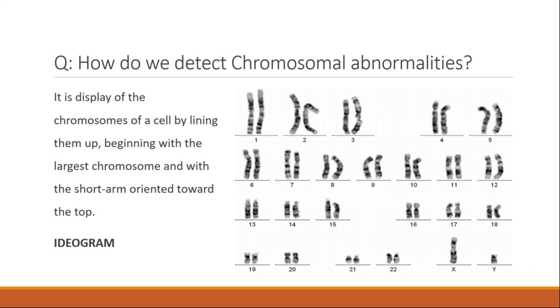Then there's a diagram of the karyotype based on chromosome measurements in many cells, which is generally referred to as an ideogram. When we take that picture, we upload it, and software is used to capture the picture of that karyotype. Manually also, for practical purposes, we do it, but generally we use the software, and that picture is called an ideogram.